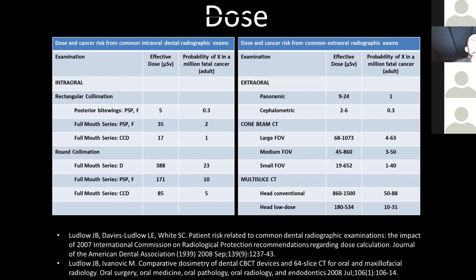Is the CT required for a particular special case, or can it be taken for every dental procedure? Again, on this one, I think it really depends on the specific scenario. We're not yet to the point, and it's overkill from a dose perspective, to be acquiring a cone beam CT on every single patient out there.